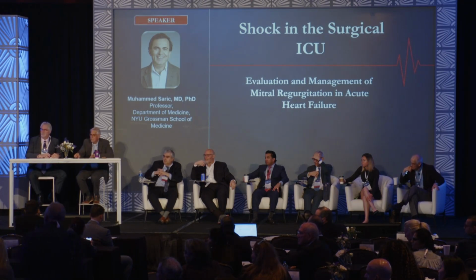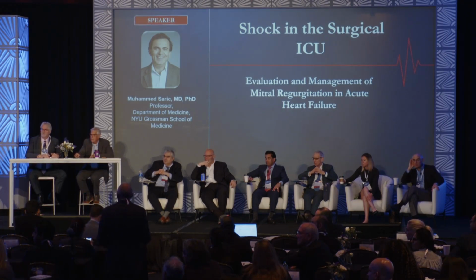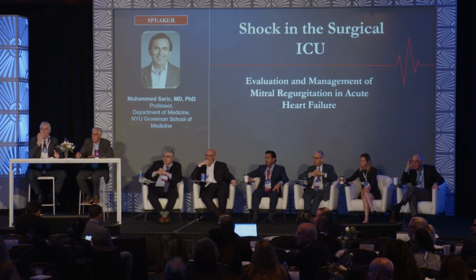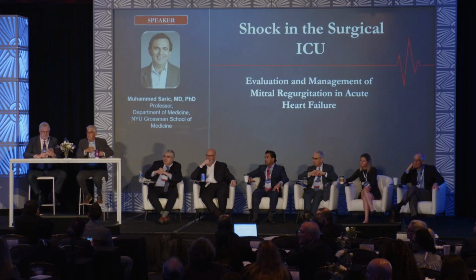Thank you for all your comments, Arvind Bhimraj from Houston here. In a VSD or an acute MR, the physiology is kind of an unloaded LV, so it gets very difficult for the Impella to unload effectively. We've had challenges leaving it in. As Dr. Gregoric mentioned, the left atrial unloading physiologically makes sense. But my question is, has anybody had a better experience doing the left atrial unloading with an axillary approach or a minimally invasive approach, so you can ambulate people and keep it longer? Because a few tandems we've done, we're kind of forced to go to the OR and they still don't do well.